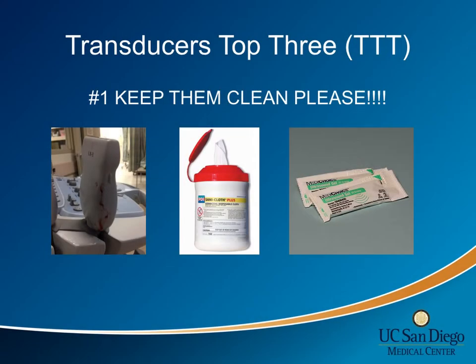A few public service announcements about the probe. 1. Please keep them clean. Wipe them down after and even before each use with Sanicloth wipes. You should also be using new individual gel packs for each patient if available.